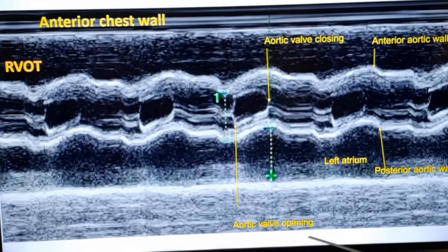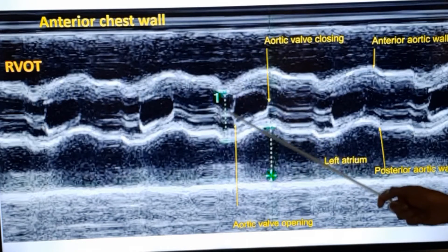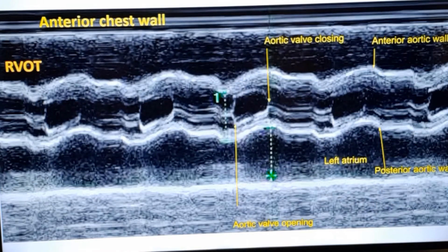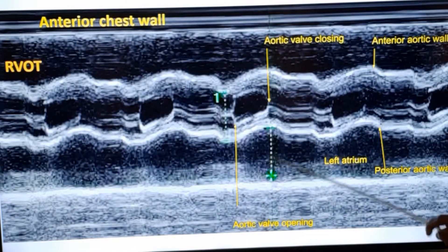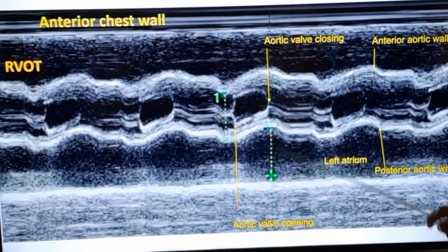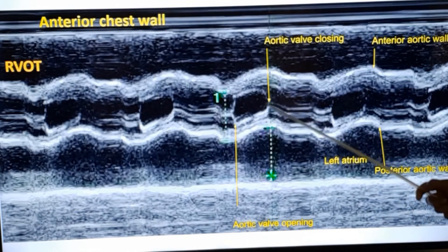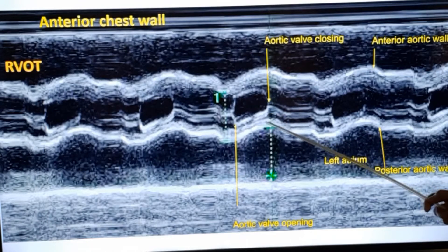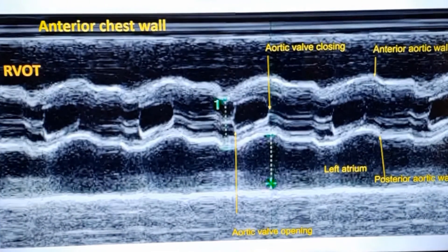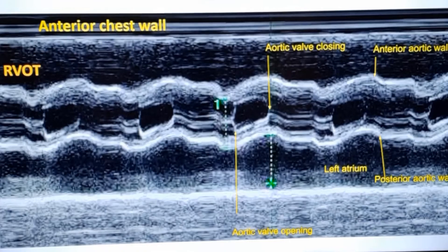The measurement will be taken for the aortic dimension in diastole. The left atrial dimension is probably the only one which is taken in systole, because this dimension is taken in end-systole. You can see that the aortic valve is just closing — the end-systolic dimension will be the maximum dimension.